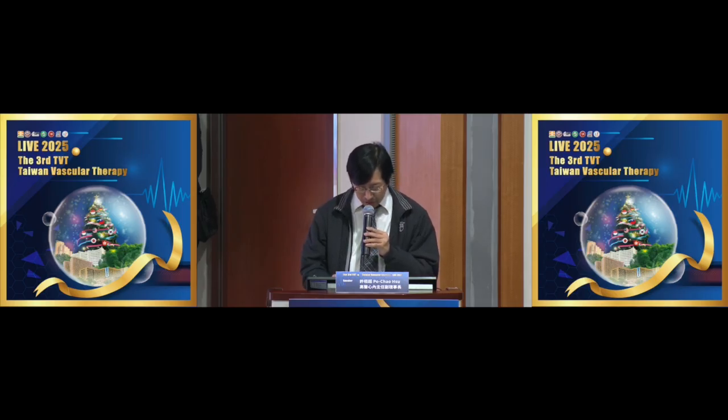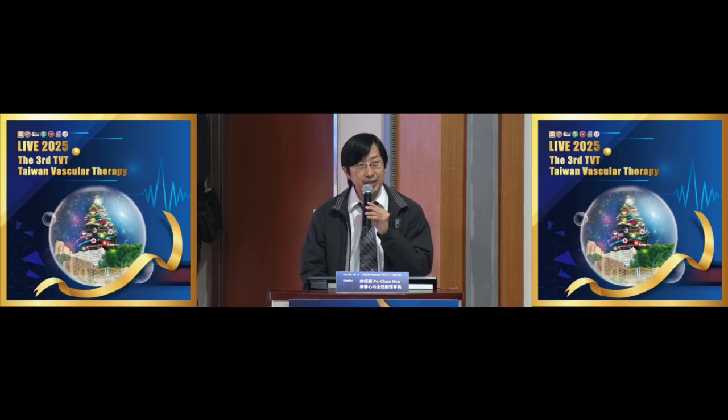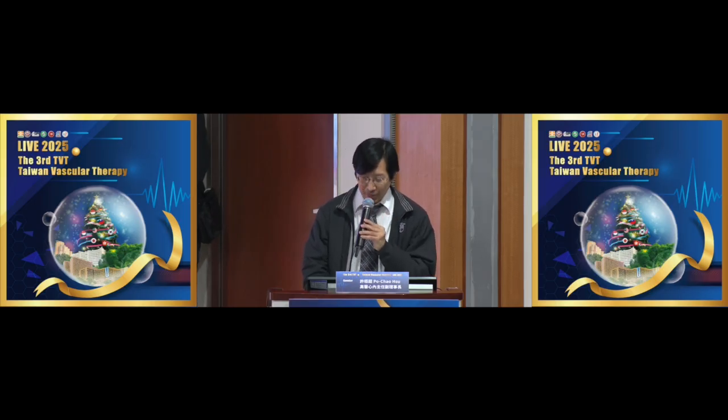Dr. Shiven demonstrated the Rotarex device, and Dr. Soga demonstrated the Jetstream device. Dr. Ren Guangli showed the BTK lesion using the RotaPro, and Ida Sensei showed us the BTK treatment technique. Dr. Dianyu Wu showed us the very wonderful chronic DVT CTO penetration and stenting. Dr. Yizhe Wu showed us the BPA for CTEPH treatment. And Dr. Junyuan Zhu and Wang Bo showed us the TAME treatment. So I think we all learned a lot from today's meeting.